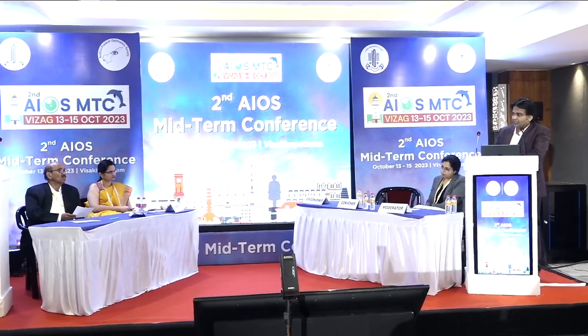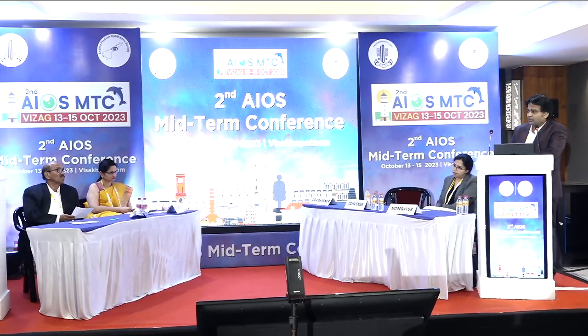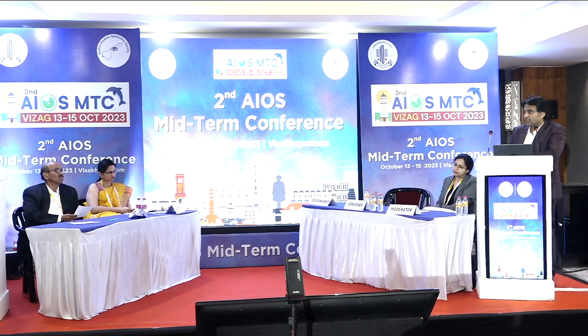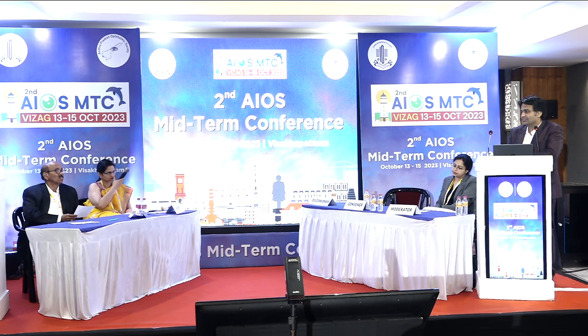First thing is contact lens. RKs and AKs are very unpredictable. Your results are very unpredictable. So the only option we have left is PRK. If there is a cataract, a customized toric IOL with the CARE group, they can customize with any amount of astigmatism.